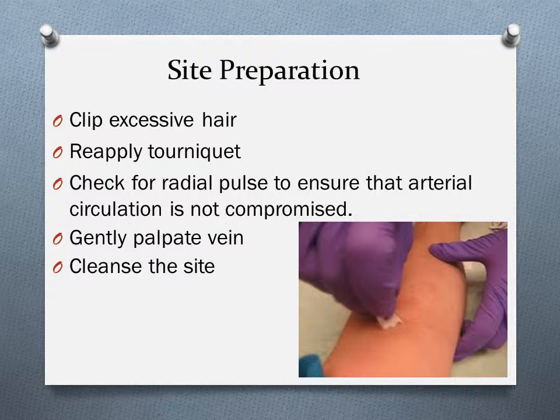Povidone iodine can be used for cleansing, but if you use that, make sure that you use a concentric circle working from the area that you plan to cannulate outward, and it has to remain on the skin for at least 2 minutes or longer to provide antiseptic properties. Make sure that you allow the site to dry naturally. Those patients that have an iodine allergy, you can use the 70% alcohol or a ChloraPrep.